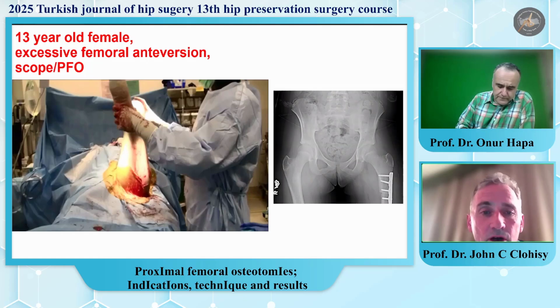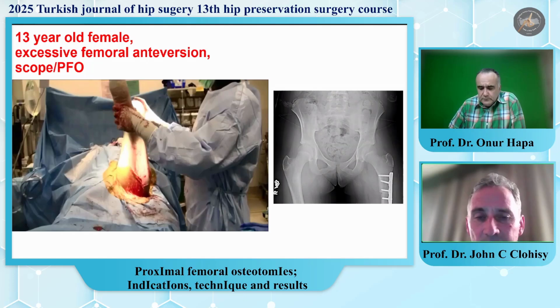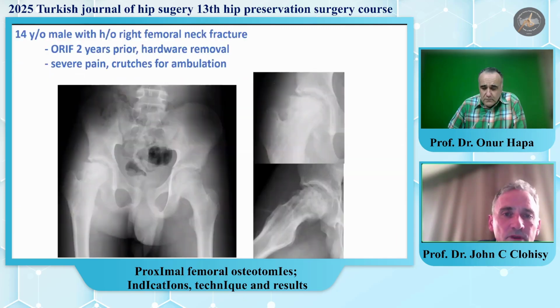Intramedullary nails are popular for osteotomy surgery, derotations. I've never really done that. I don't like to go through the abductors with the nail for the osteotomy. I do like to take all the hardware out after the osteotomy, so that would be another surgery through the abductors. So I prefer just to use a short, large frag compression plate, and I have also noted great healing with that plate. So that's my approach to the simple derotation, and that can be in isolation or in combination with a PAO.